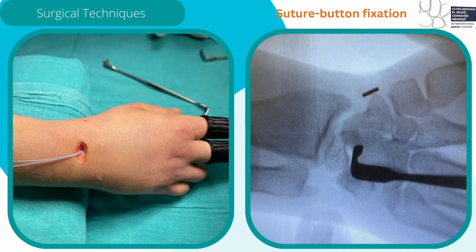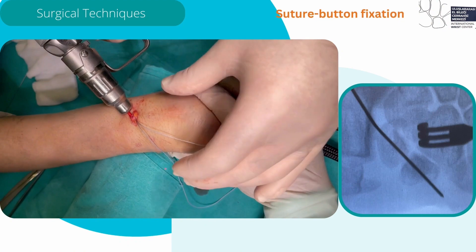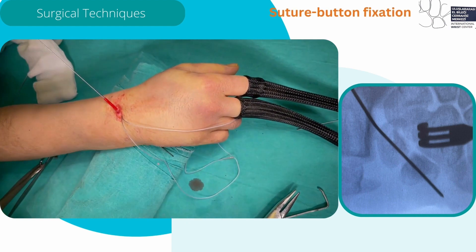The position of the first button is checked under fluoroscopic imaging. Then the proximal part of the lunate is exposed. A second guide wire is then directed towards the triquetrum from the lunate. Its position is confirmed under fluoroscopic control.